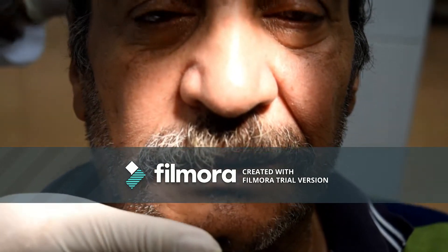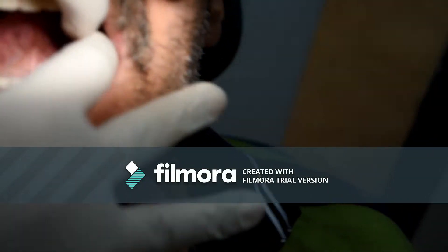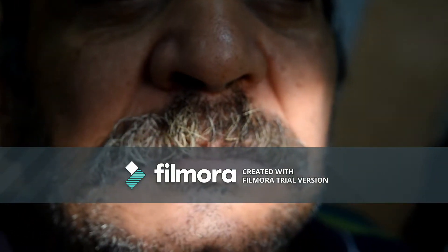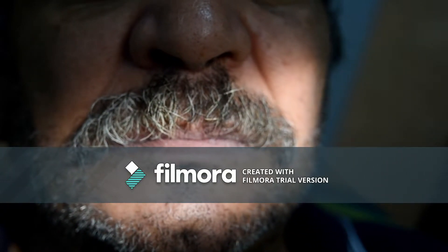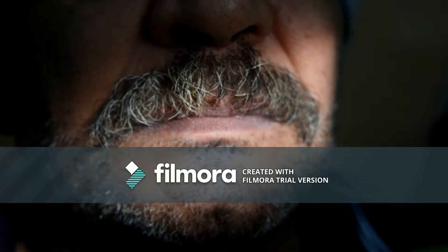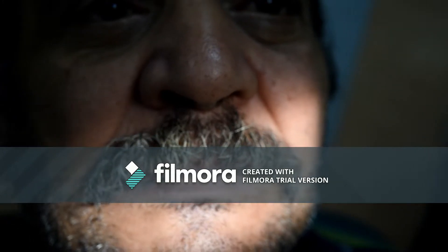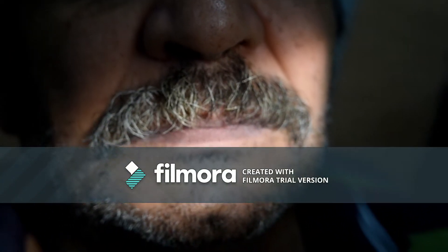After that, we have to check the centric relation of the patient. The centric relation should coincide with the centric occlusion of the patient. If the centric relation is incorrect and it is minor, it can be corrected. If it is major, the lower posterior teeth should be removed, a new bite registration taken, and remounting with another try-in should be made.